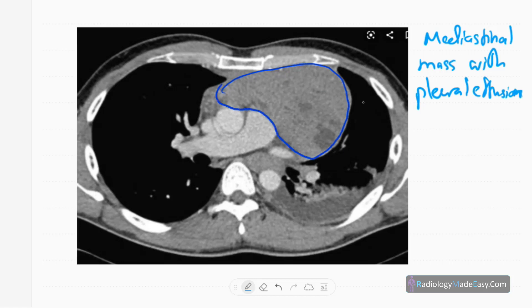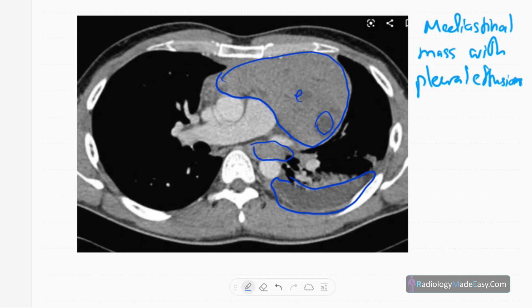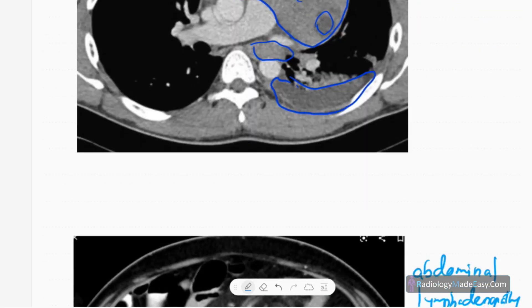This CT shows a large enhancing mediastinal mass with some necrosis due to its size, along with an associated pleural effusion. Pleural effusions are not a common presentation of lymphoma but can occur. This is another lymphoma presentation in the chest.